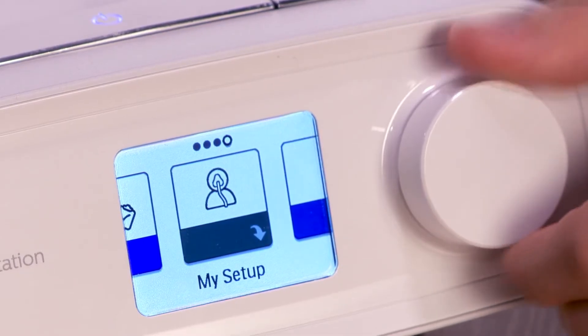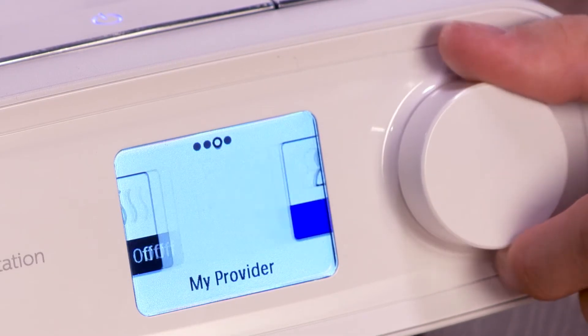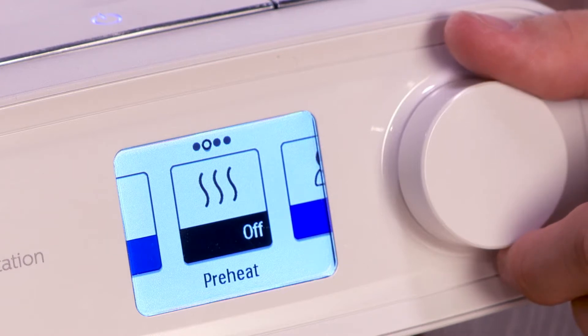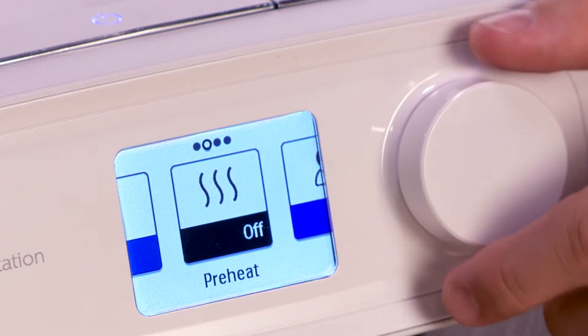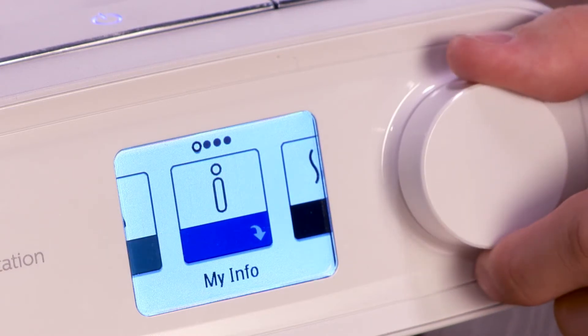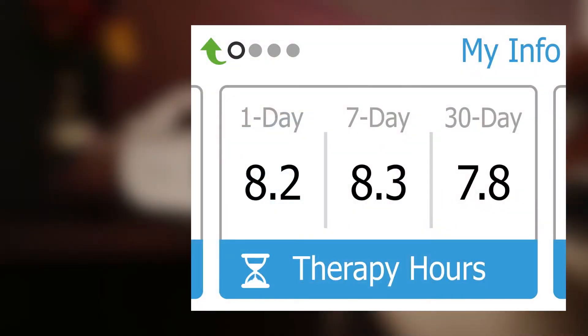Note that Preheat only displays when an optional humidifier is attached. Options with a down arrow have submenus or additional screens. To make a selection, press the control dial.